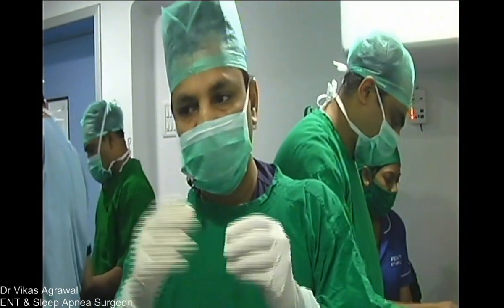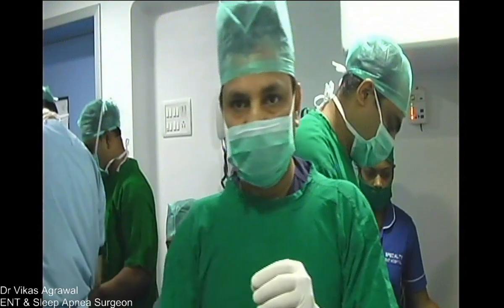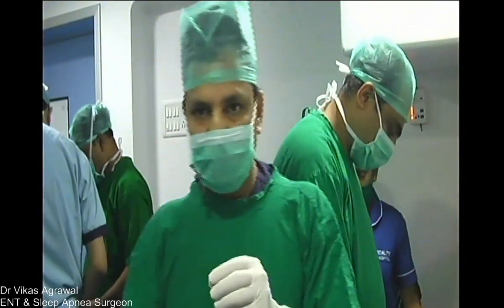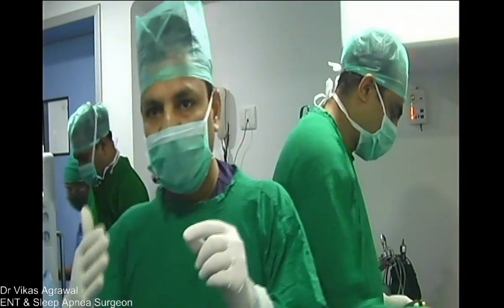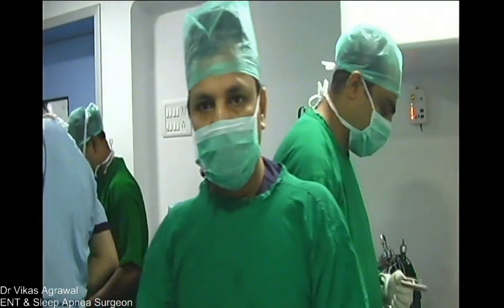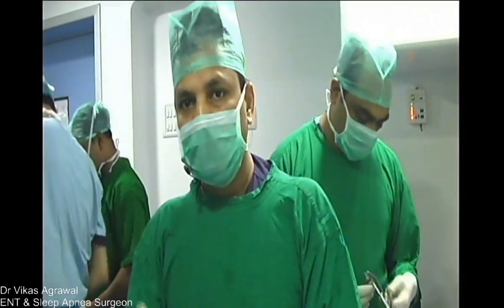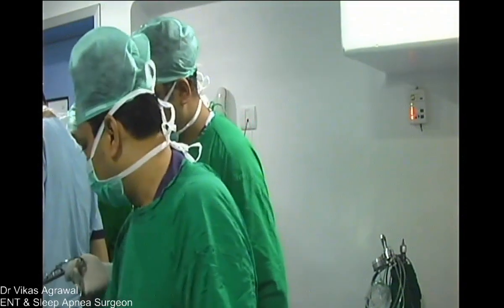The medial fibers and the lateral fibers are dispensable, only the vertical fibers are not. So we'll leave the vertical fibers and we'll remove the medial and the lateral fibers of palatopharyngeus, because all the techniques of palatal surgery revolve around tackling the palatopharyngeus, either suturing or just apply the mouth gag.